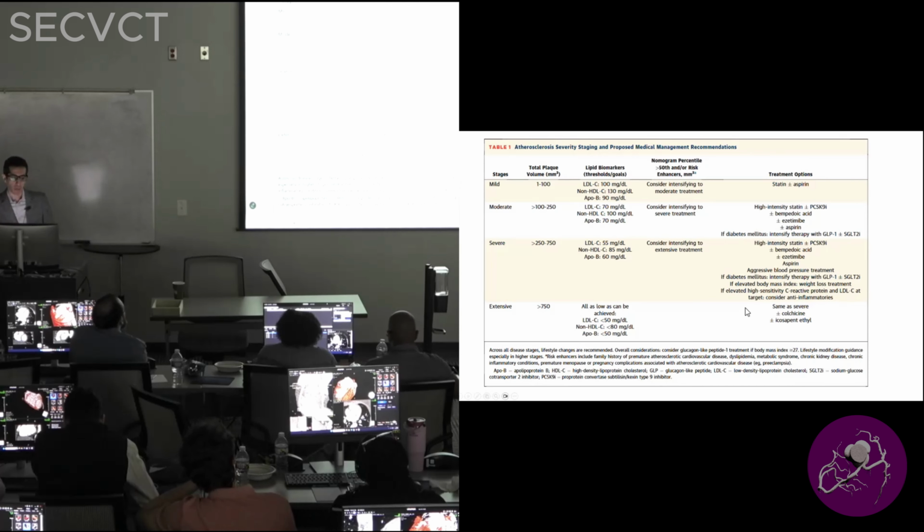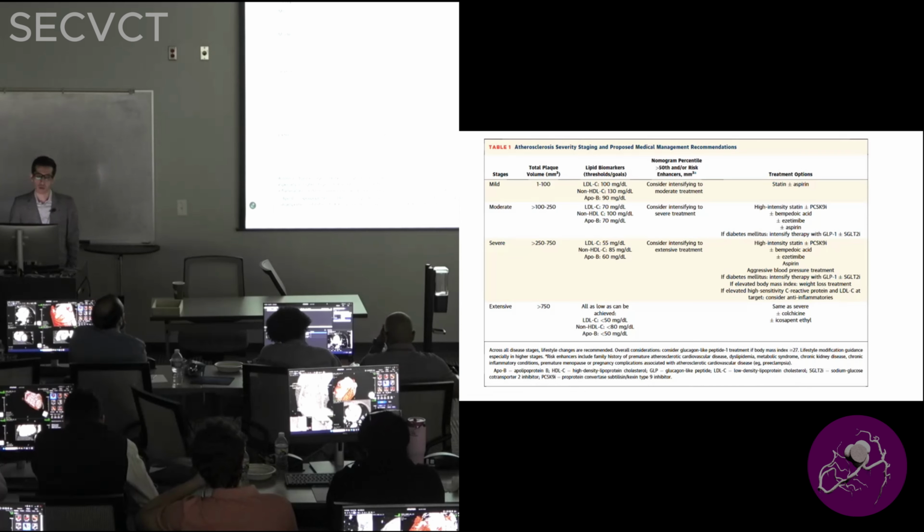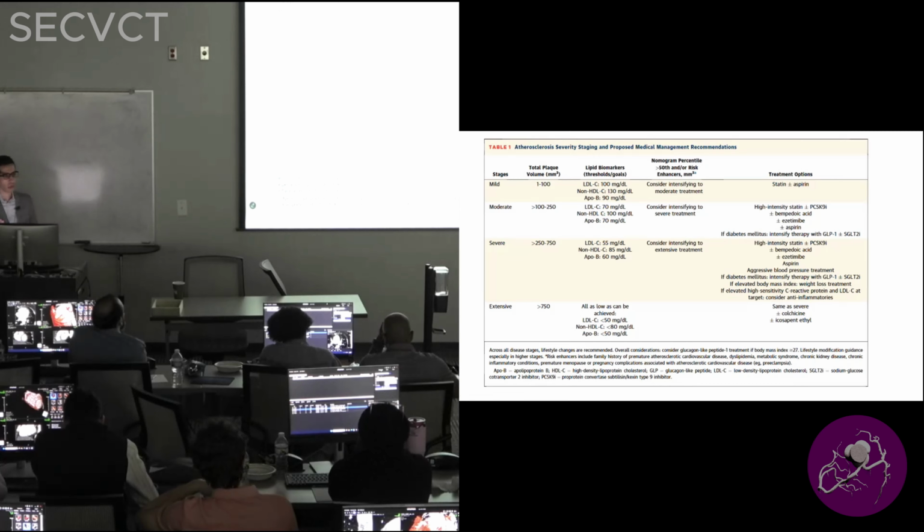So I think we're trying to come up with a way to help the ordering folks. And remembering the plaque stage system is to some degree helpful. I argue that anytime you have significant plaque, in general above 250, specifically for the young folks, and extensive, which is more than 750, it's worth mentioning that in the impression. And even some healthcare systems will say maybe refer to preventive cardiology clinic to take it to the next level. As you can see, those who are treating cardiology patients, the LDL goals, the lipoprotein, sometimes, and more importantly, the indication for adding other agents.